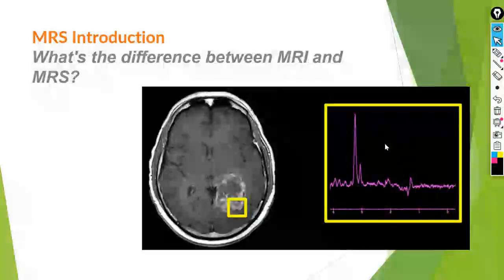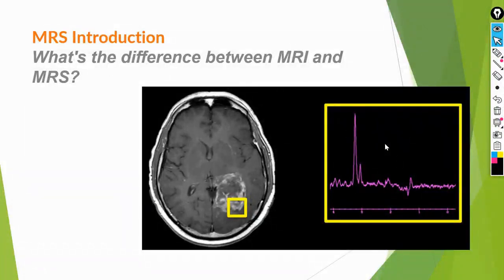For instance, if I have a tumor, this tumor is a result of a certain pathology or specific problem. This problem increases the concentration of some metabolites and decreases the concentration of others. If I can determine the concentration of the metabolites present in my pathology, it will give me an indication of the type of problem. And if I am following up with you and the situation has gotten worse or something like that, then knowing about your internal condition is very important.